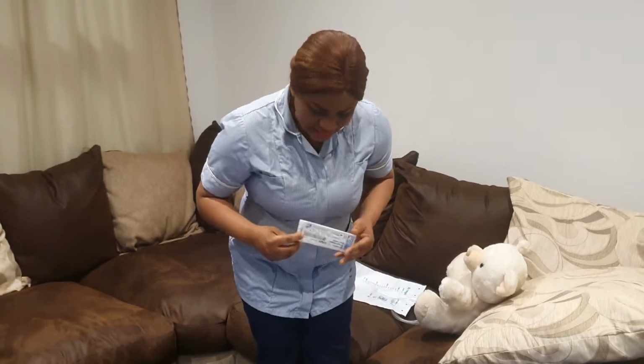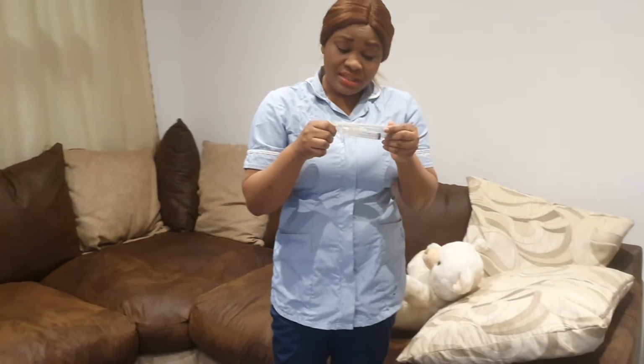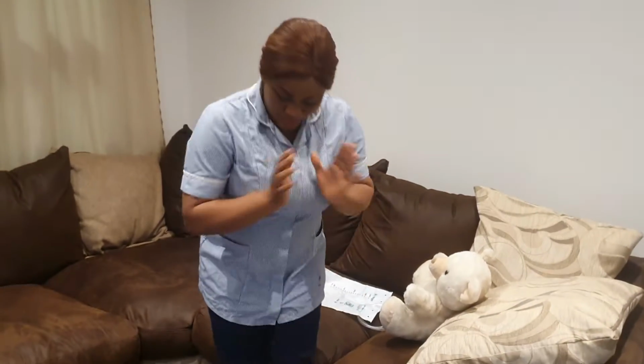So this is my 10 ml syringe. Is this 10 ml or 20 ml? I'm not too sure. All right. So this is my 10 ml syringe. This syringe is still valid. The expiry date is 2025. It's valid and I'm happy to use it. I pop this on my tray.